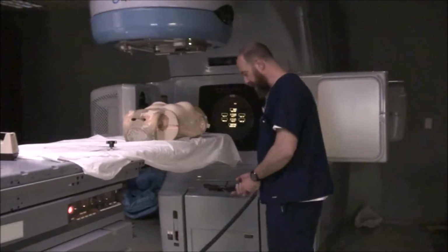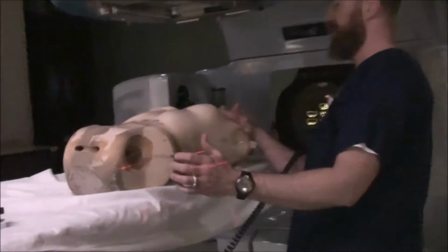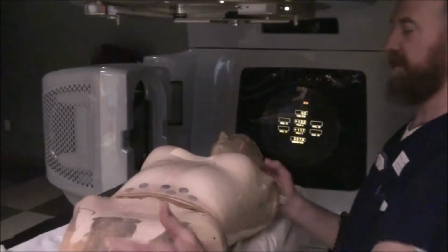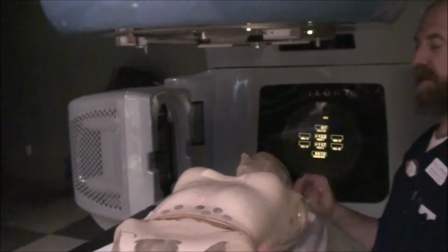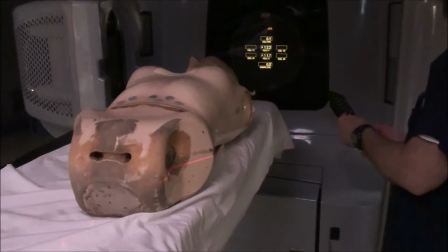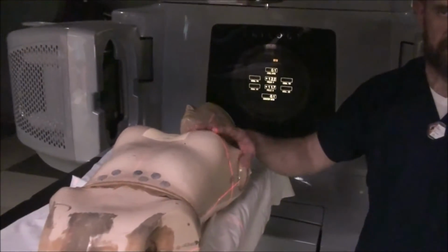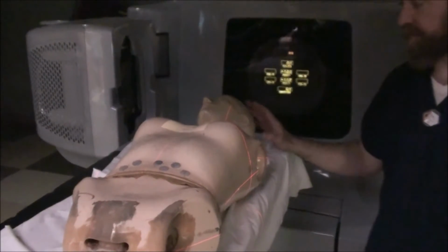Get the patient on the table, and you want to get her straight with the laser, right from SSN all the way down through here, xiphoid, all of the same stuff we do every time. Since we are doing a breast, you want to have the face turned. If you're treating the left side, have the patient look to the right.